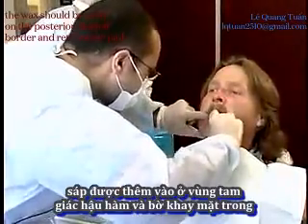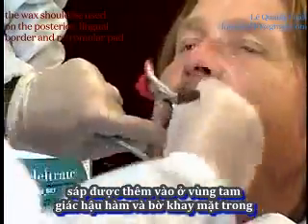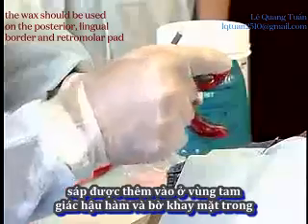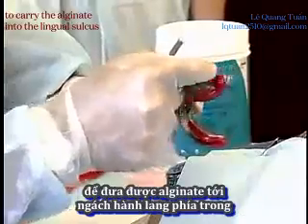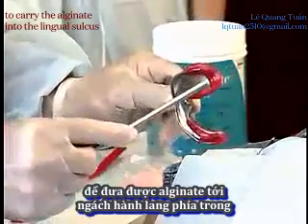The wax should be used on the posterior lingual borders and retromolar pad to carry the alginate into the lingual sulcus.